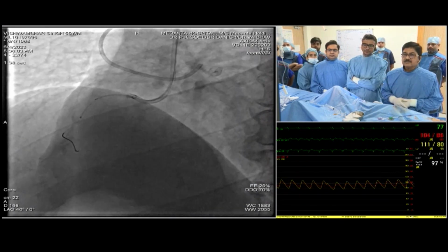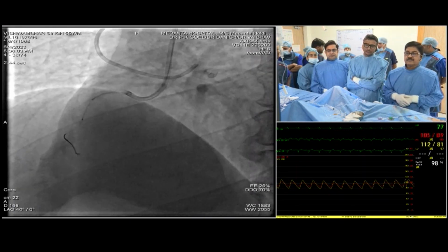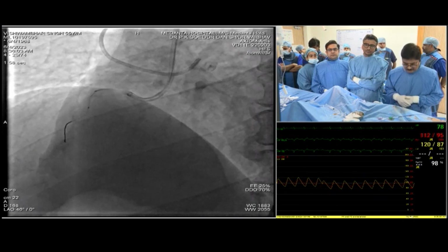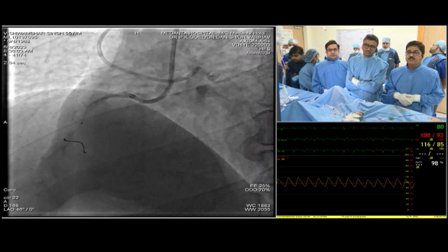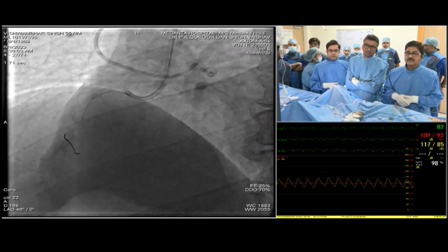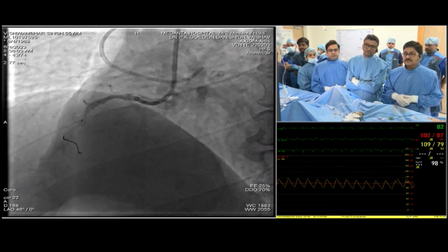Yes, IVUS now. Will you take an IVUS with your usual technique of dual lumen catheter with IVUS, or what will you do? Firstly, we can do it just for confirmation. Okay, that's all. And actually this bridge has a very nice diameter. Maybe we have the chance of inserting IVUS and confirming whether this one is in the CTO region or not.